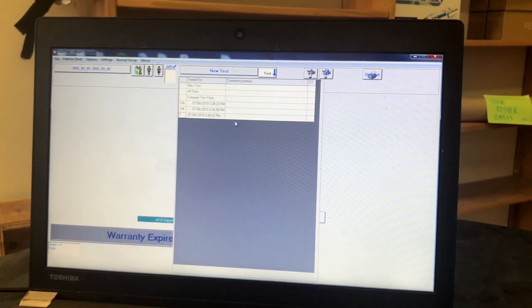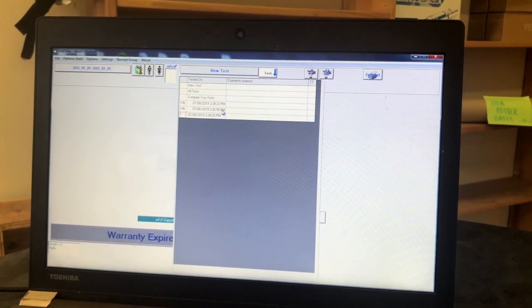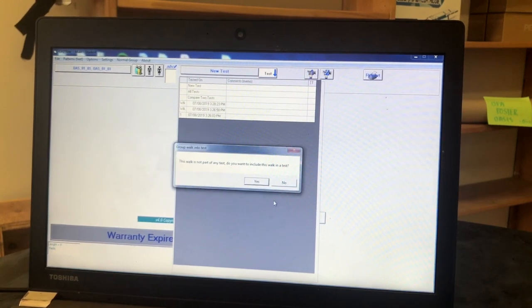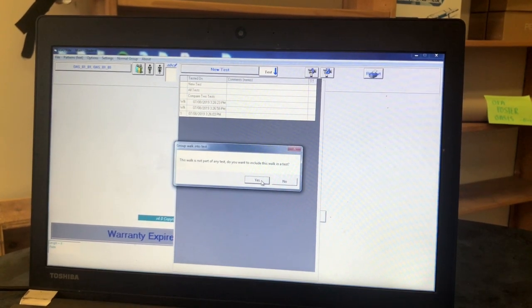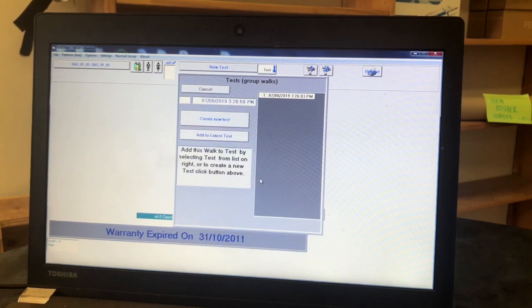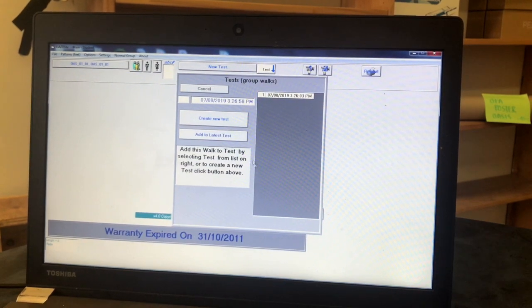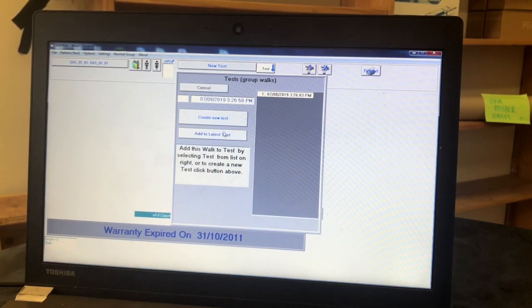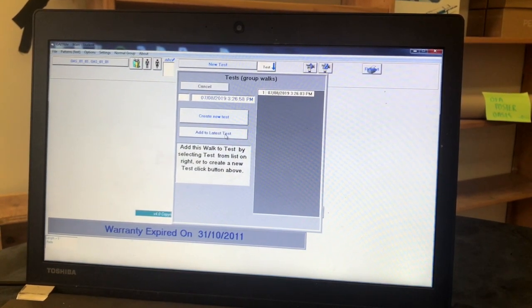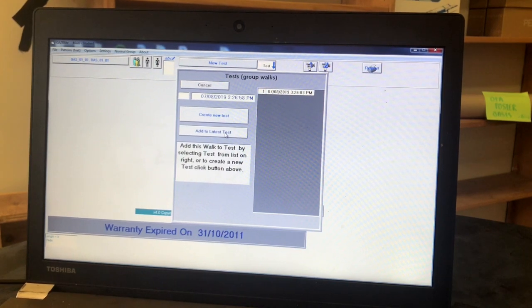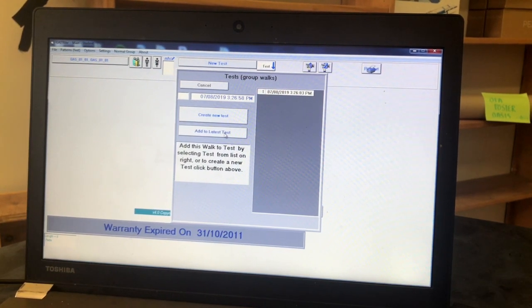Instead of having WLK shown beside your walk, you will now see a number one. This is how you know it is now part of a test. Click on another one of your walks that has a WLK beside it. The same pop-up message will appear asking if you want to include it in a test. This time, when you say yes, it will take you to another screen.